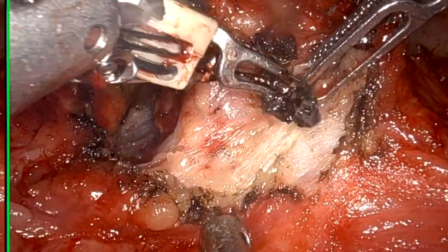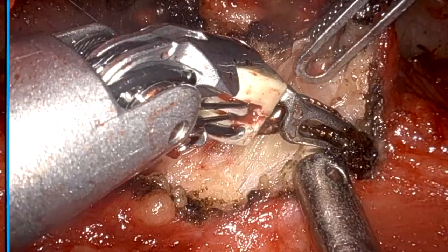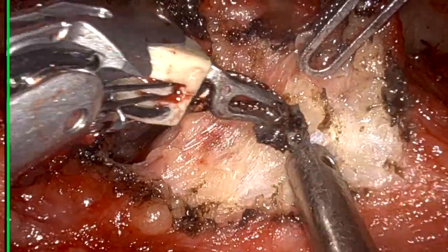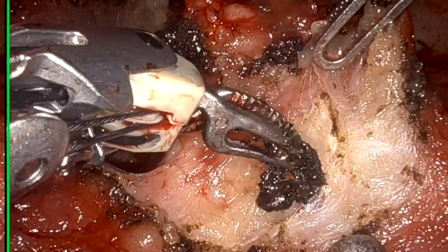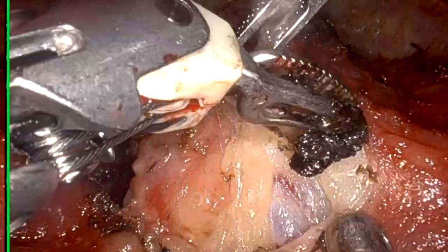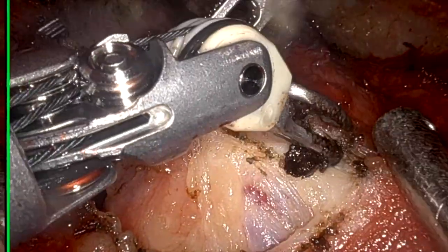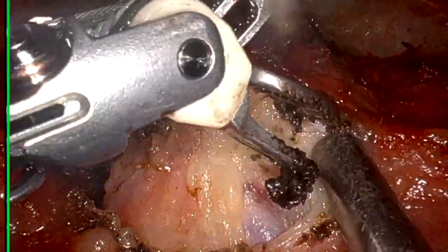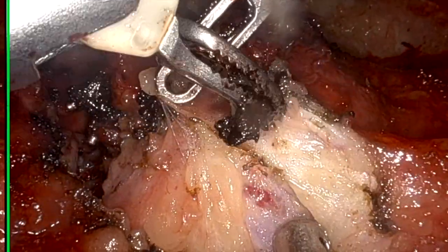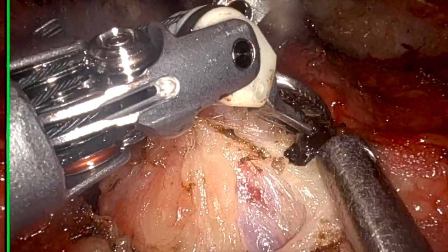So we go layer by layer, from above downwards. And we got the vein. Can you see the vein? Yes, here it is. So once I saw the vein, I again changed my direction. One more vessel.